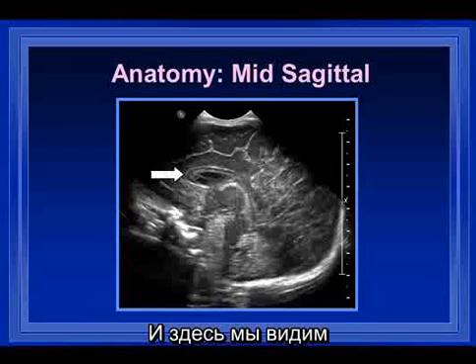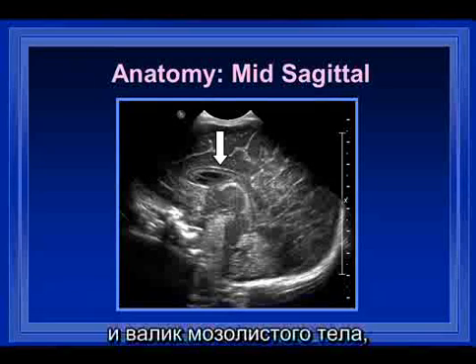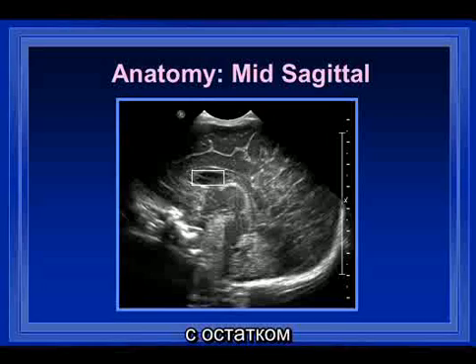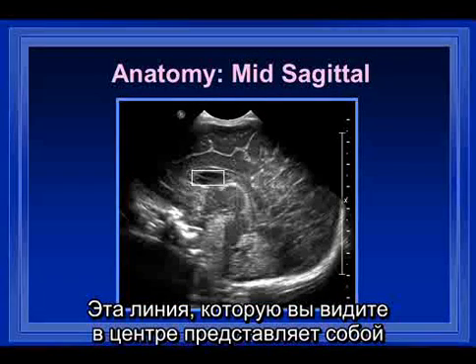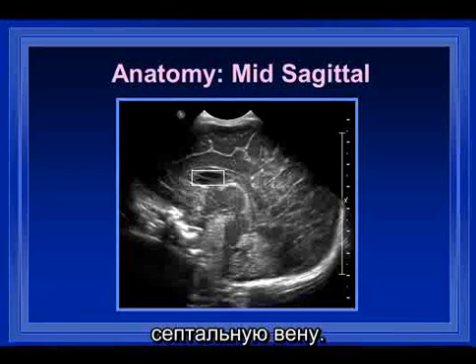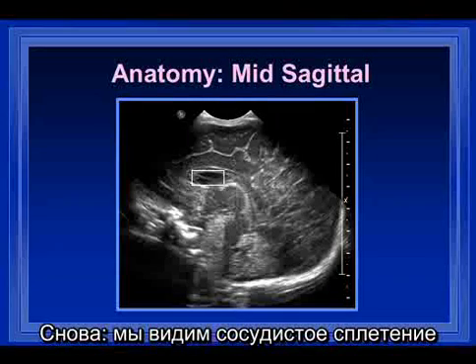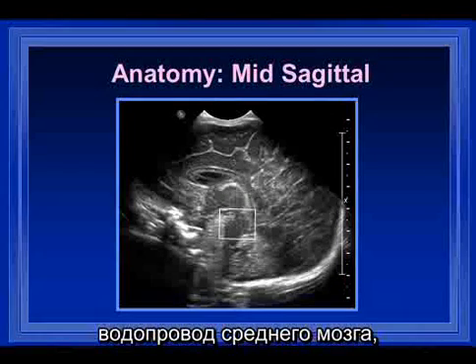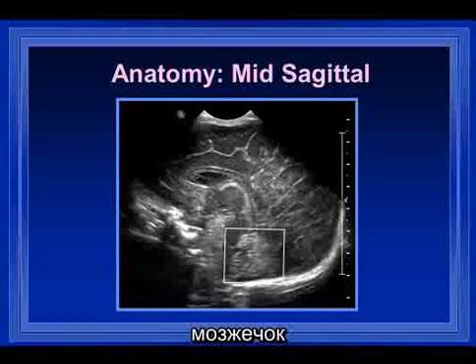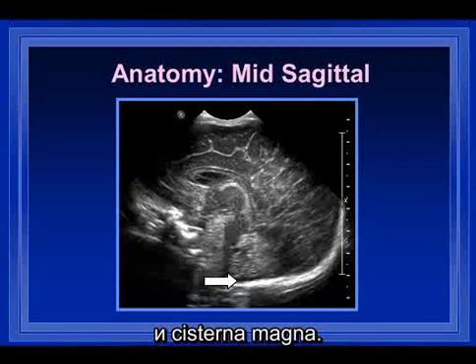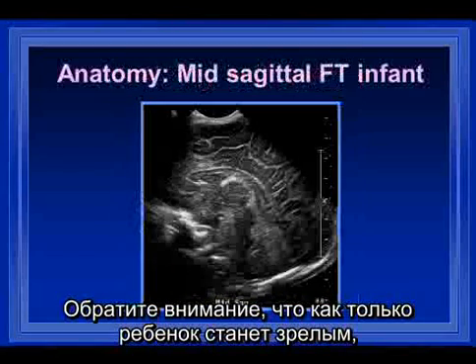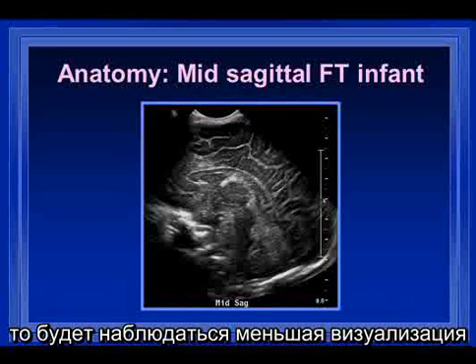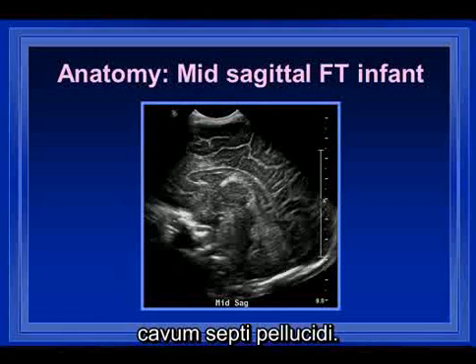This is a baby who's somewhat more mature. You can see that there are more convolutional markings; they're a little bit serpiginous, which happens as they develop. Here we have the genu, the body, and the splenium of the corpus callosum with a remnant of the cavum septum pellucidum. This line seen centrally represents a septal vein. Again, choroid plexus in the roof of the third ventricle, the aqueduct, the fourth ventricle, the brain stem, cerebellum, and cisterna magna.